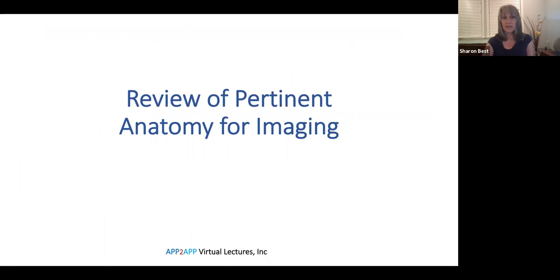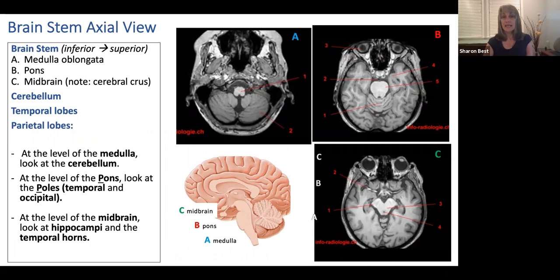Here's a review of pertinent anatomy to look at this patient's MRI. We remember the medulla, pons, and midbrain. At the level of the medulla, we're looking at cerebellum. At the level of the pons, we want to pay close attention to the anterior temporal poles and the posterior occipital poles. At the level of the midbrain, we want to pay close attention to the right and left hippocampus.